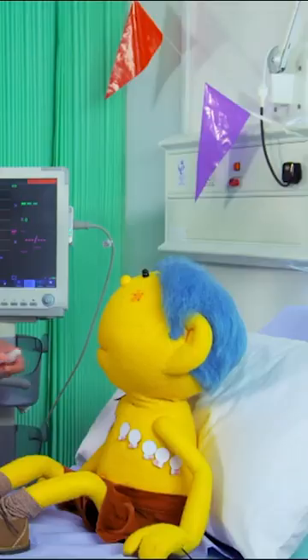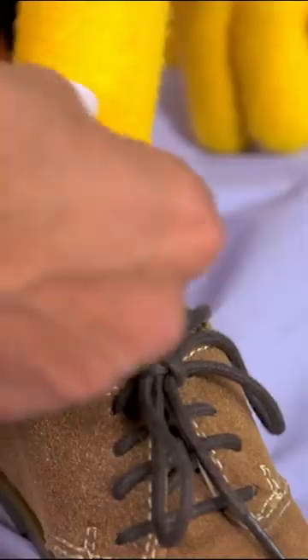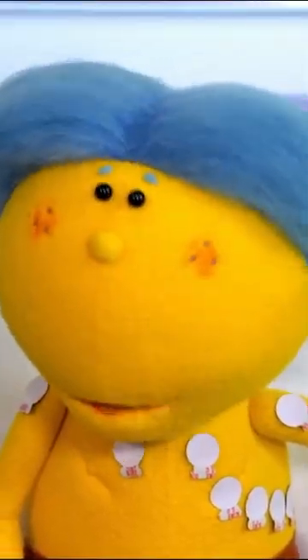And some more for the top of your arms. And finally, on your ankles. There we go. Wow, that's a lot of sticky dots.